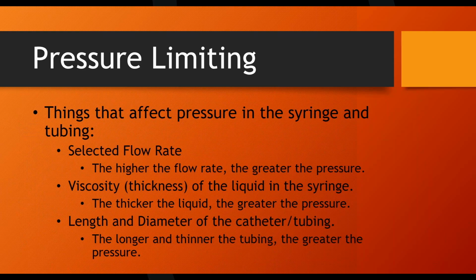So what they'll do is the contrast bottle will be kept in a warmer. When it's time to fill the syringe, they'll get the bottle out of the warmer, fill it up, and if the patient's on the table right away, they'll just use it. But if the patient's not going to be here for a while, they'll take the syringe off and put the syringe in a warmer. And then when the patient shows up, they'll get it out, put it back on, and fire away.